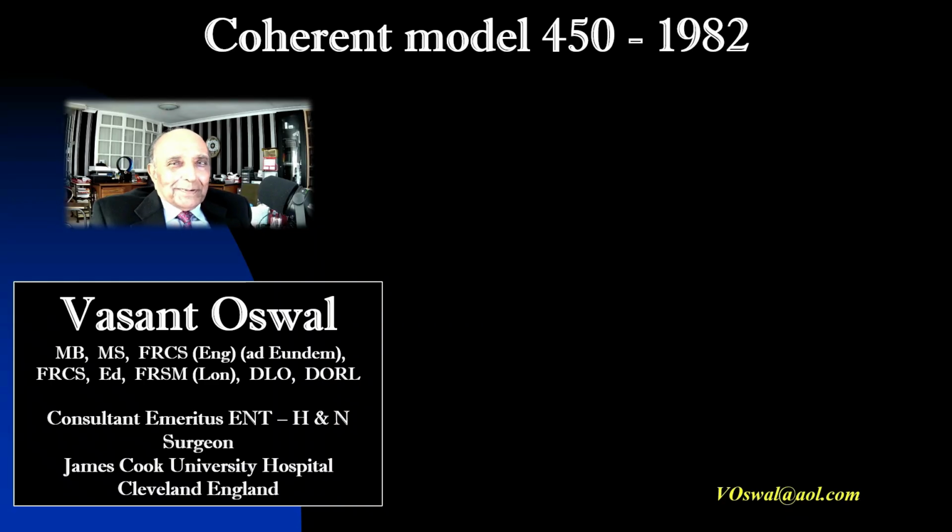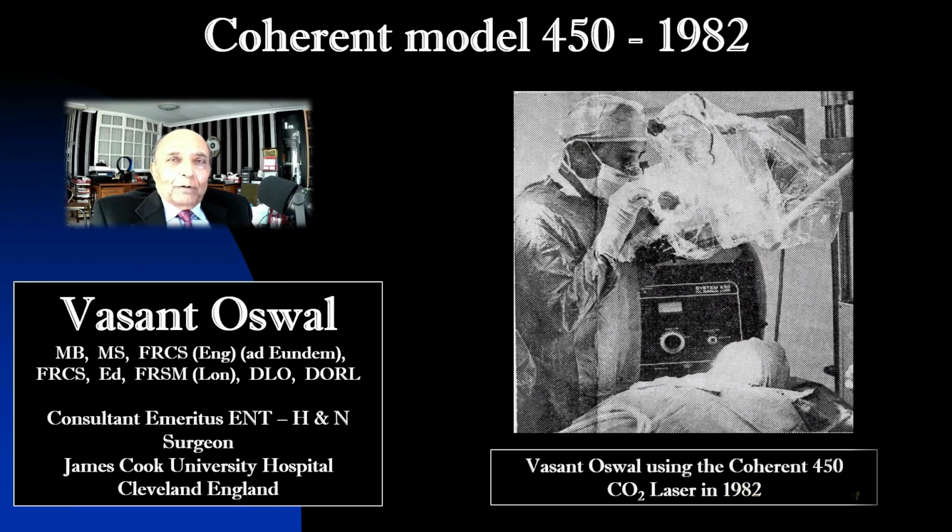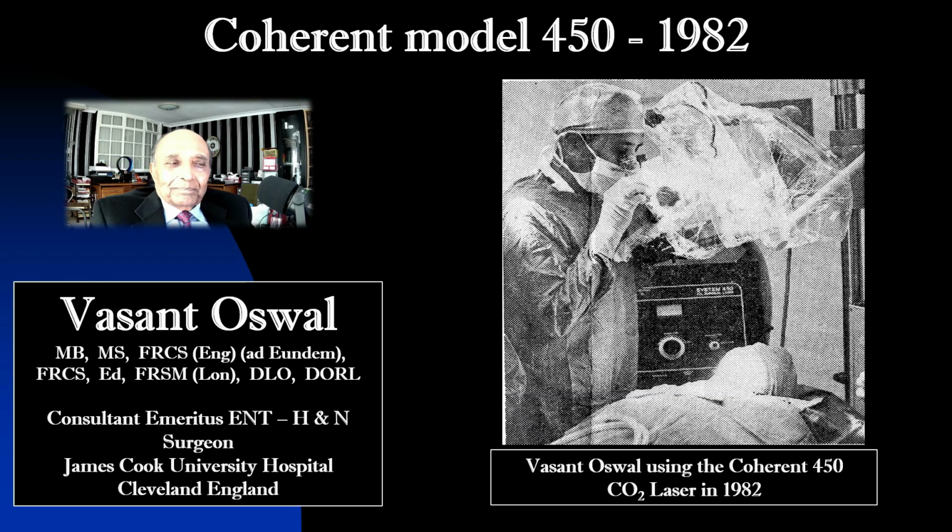It was now 5 weeks since we got our laser. The anticipation in the hospital and also in the town was almost palpable. When was I going to use the laser on patients? Who would be the first patient? What would be the surgery? I was confident enough now, knowing all the effects of the laser on the tissue and also its limitations. So I chose a young patient who had a fibroma on his tongue.